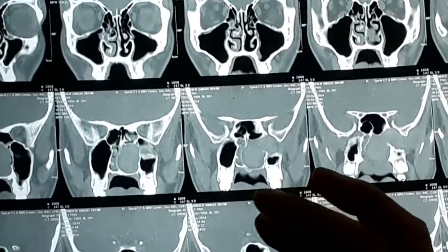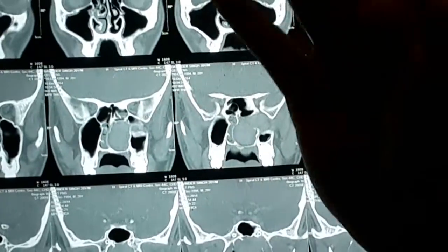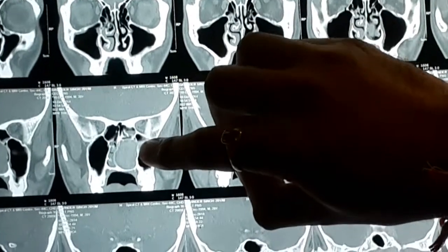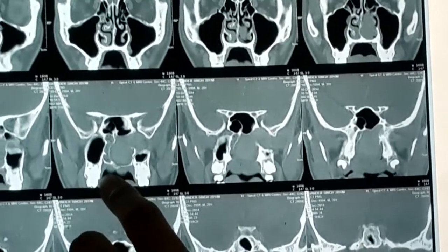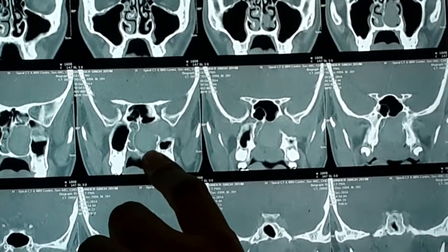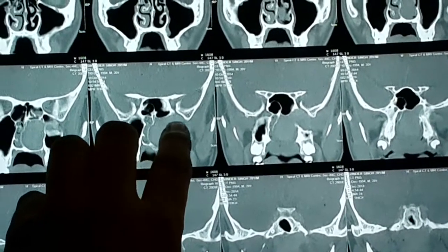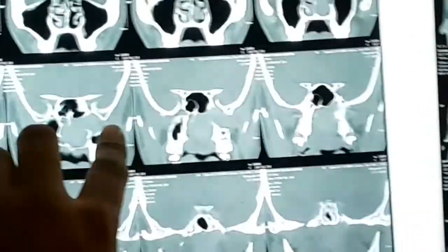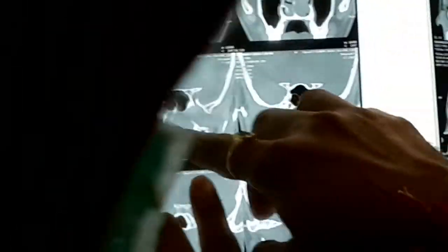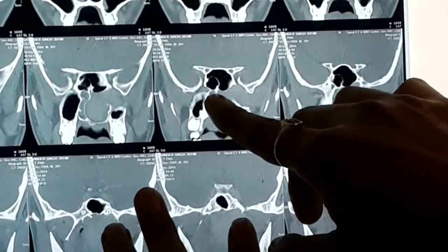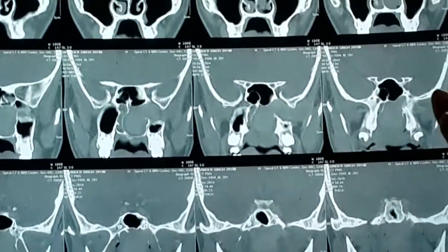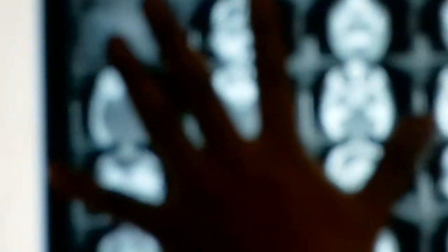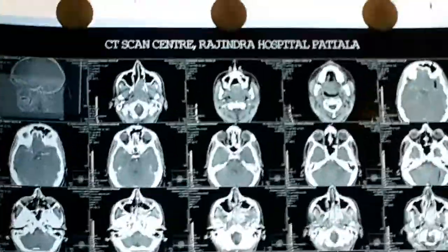The second thing is — look from here — when you go behind, where can the tumor go? It has a propensity to spread to certain areas. It's not like the angiofibroma can grow anywhere. It arises from the sphenopalatine foramen lip, and then has a tendency to go laterally as well as medially. It is growing medially into the nasal cavity and then into the nasopharynx, and laterally it is going into the pterygopalatine fossa. On non-contrast you cannot differentiate it from the muscles; you just see opacity, so non-contrast doesn't carry much value beyond this. Now come to the contrast.